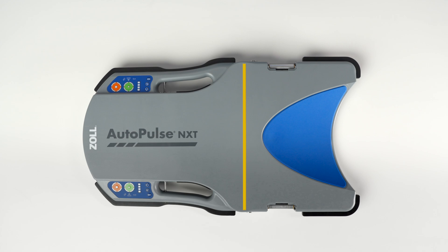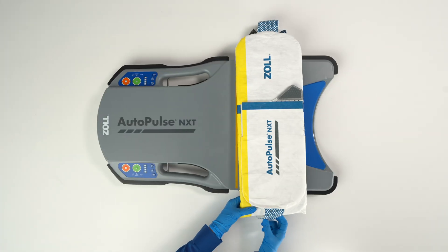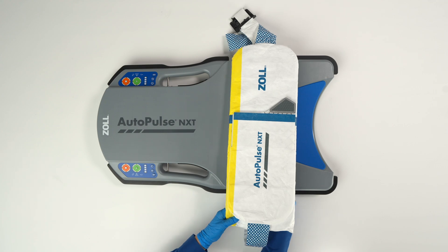To install the AutoPulse NXT band, place the platform on a flat surface with the patient side face up. Place the band on top of the platform, aligning the yellow lines on the band with the yellow line on the platform. Starting on one side, orient the band in a U-shape, ensuring there are no twists.